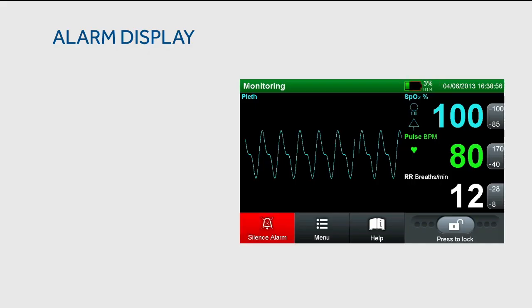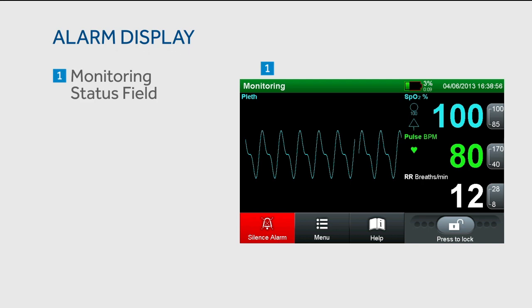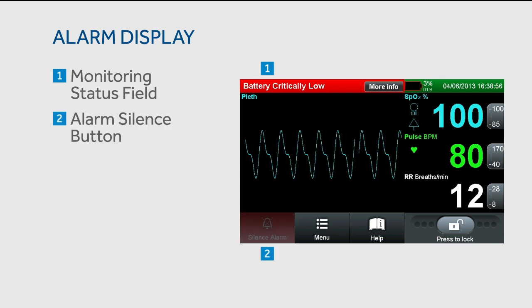When an alarm occurs, it will be visually highlighted in the monitoring status field and in the parameter of concern. The monitoring status field will flash for medium and high priority alarms. Audible alarms are also provided unless disabled. Users can silence the alarm by touching the alarm silence button. Alarm silence durations may be adjusted within the monitoring settings menu. Select more info to view additional detail about the alarm.